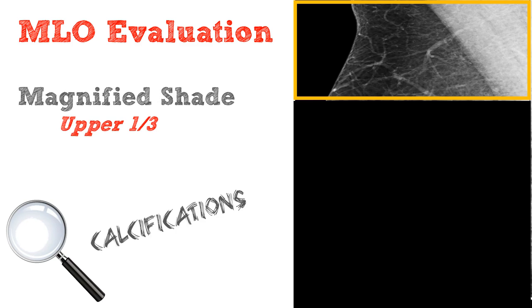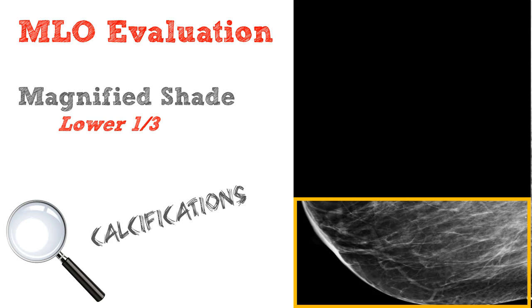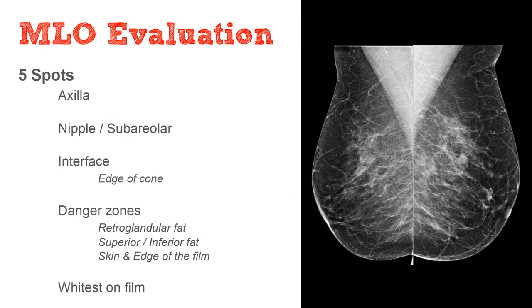From here, we're going to magnify the image and again repeat those same steps, looking at the upper third, the middle third, and the lower third of the breast. In this magnified view, we're looking specifically for groups of calcifications. From here, we are going to look at the 5 key spots that we want to ensure we include in our evaluation of every MLO view.